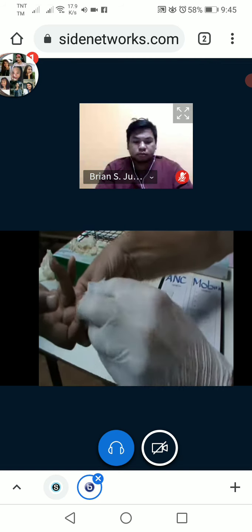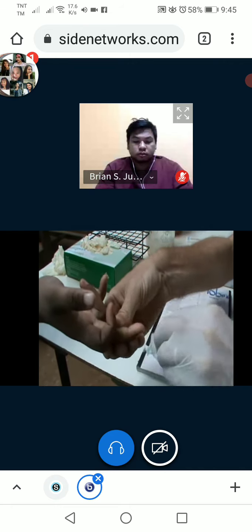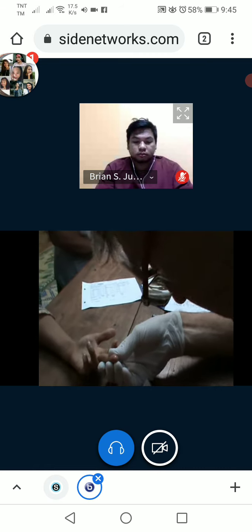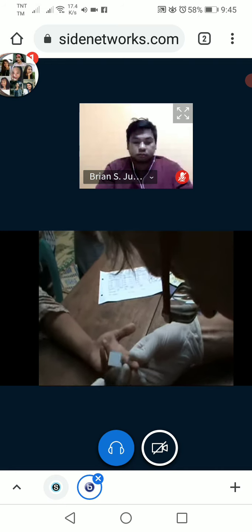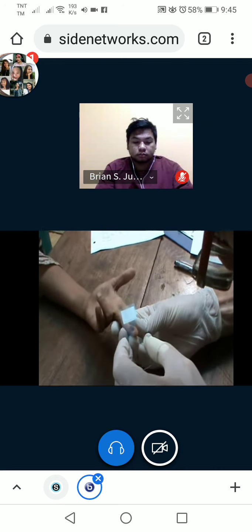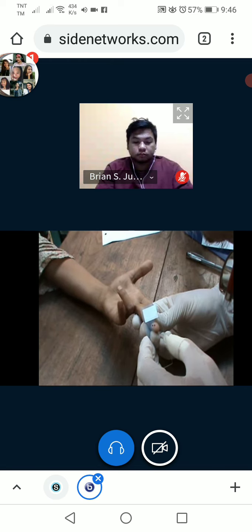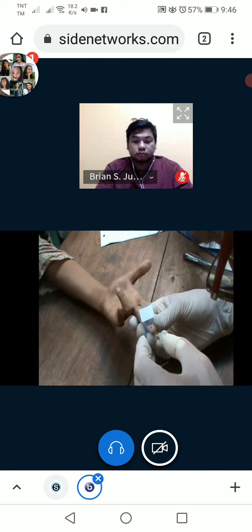With a dry and clean piece of gauze, wipe out the remaining alcohol and the first drop of blood as it may contain skin debris. Press the finger to have a blood drop come out. Bring the slide to make contact with the top of the blood drop, but not with the finger. This is crucial if you want to take a standard blood quantity and have a thick blood smear with a standard thickness. Repeat this in order to obtain 2 to 3 drops of blood for the thick smear. If the drops are small, take 3. If they are a bit bigger, take 2. The volume of blood for the thick smear should be about 6 to 10 microliters.